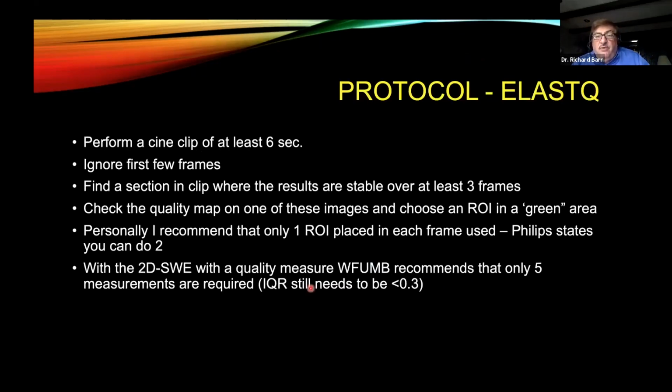So this is the protocol we like to use for ElastQ, or the 2D shear wave, since it's real time. We do all the things we've talked about: supine or right lateral decubitus position, probe parallel to the liver capsule between the ribs, patient holds their breath, stops breathing, all those things we talked about, placing the ROI about 1.5 centimeters below the capsule. Get the best B-mode image. Then when you ask the patient to stop breathing and you notice on the B-mode they stop breathing, you start collecting a cine clip. And a 6-second cine clip is probably adequate.